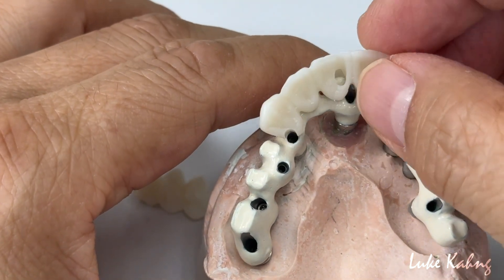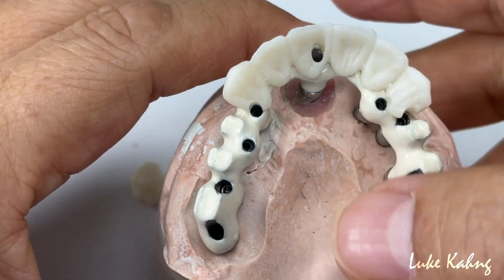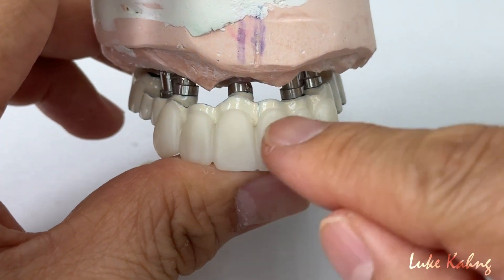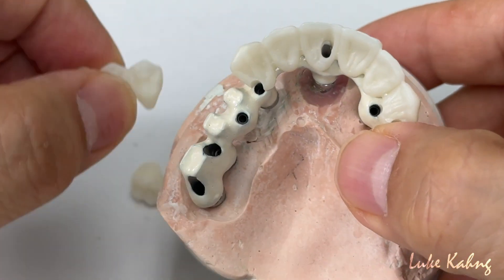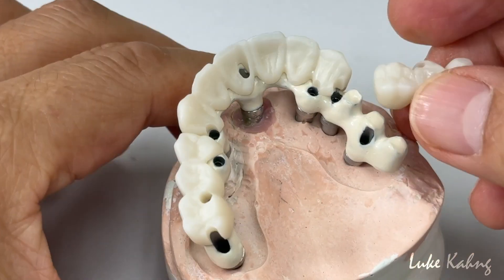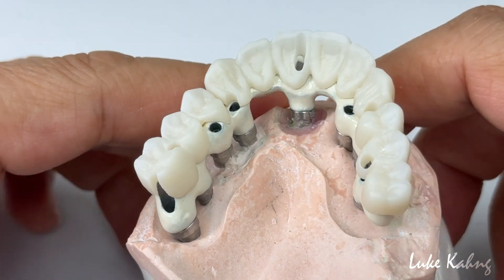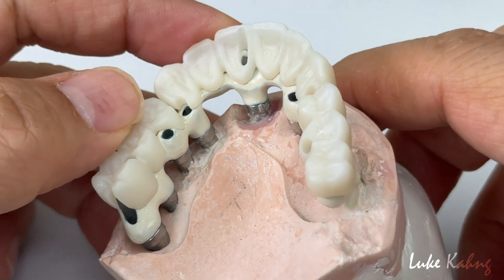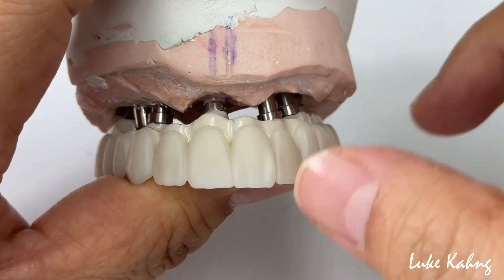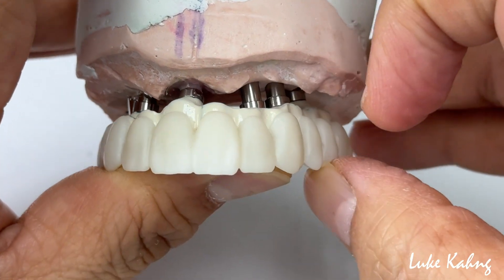We make the six-unit section like this. The gingival area is in pink, and the three-unit side is side by side. For all the rest of the areas, we put pink porcelain down there — no composite. This is the monolithic approach, and we can segment it between the teeth to make the tooth look better and more natural.